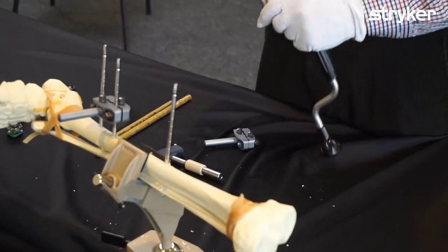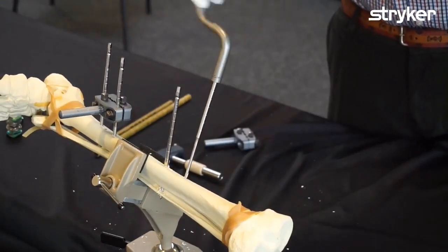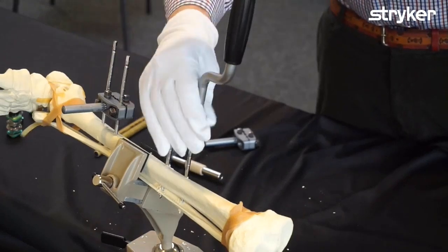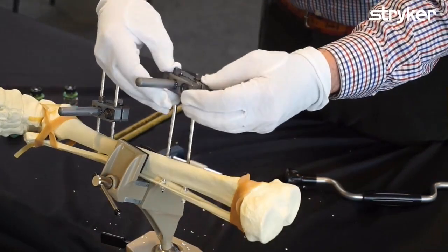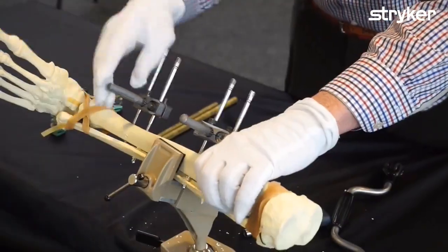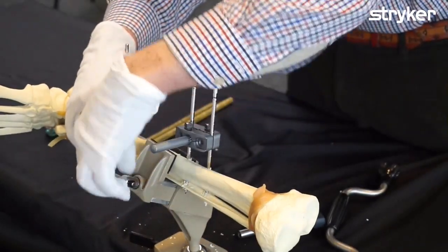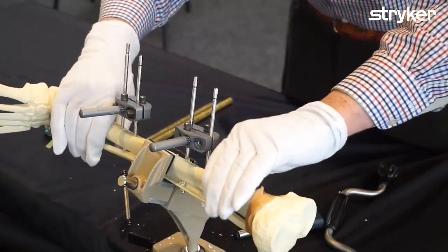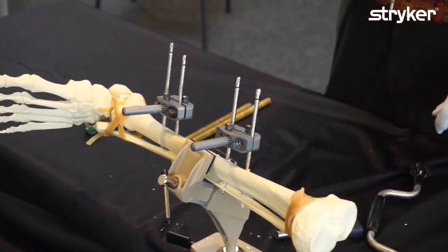Now we're going to make the other pin group. Once both pin groups are in place, you can use them to reduce the fracture — to make the fracture alignment as good as possible. Then I want to use first just one bar.